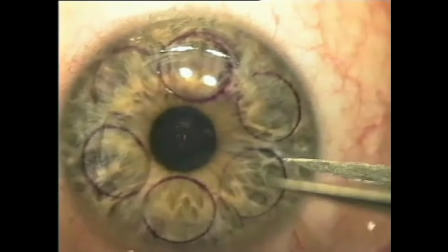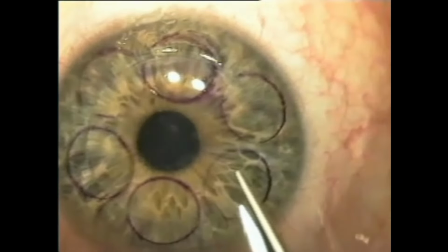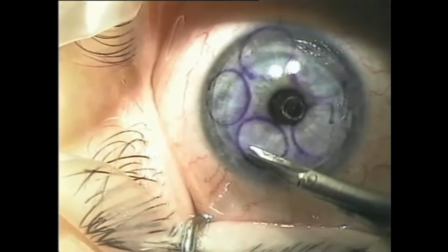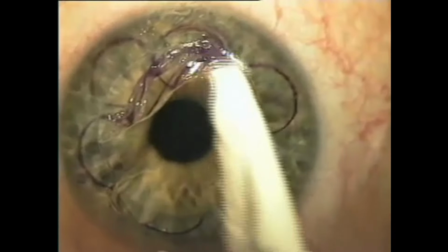A modified jeweler's forceps is then used to dissect the flap edge, and a Merocel sponge can then be used to peel the epithelium in areas that do not elevate spontaneously. The use of a modified jeweler's forceps allows for easy separation of the epithelium from the underlying stroma along the margin of the trephination. In certain locations, this may not be easily done. We have, however, incorporated some modifications, such as the use of a modified Vannas scissors, to assist in creating a more even flap edge. The Merocel sponge is used to dry the Bowman surface, followed by excimer laser ablation.